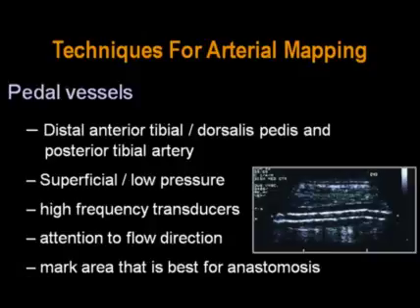The examination is then carried out to the level of the pedal vessels, where we evaluate the distal anterior tibial artery, the dorsalis pedis artery, and the posterior tibial artery as they enter the foot. These vessels, again, will be very superficial. You want to use high-frequency transducers. Be careful not to apply too much pressure over these vessels as, again, in these low-flow situations, any pressure at all may compress the vessel and make it appear as if the artery is occluded.